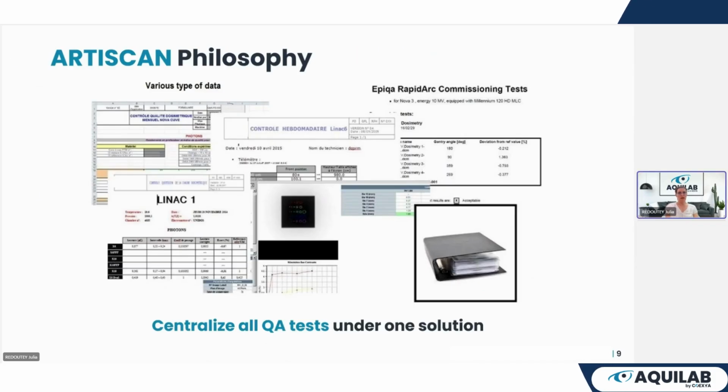So what's ARTISCAN philosophy? ARTISCAN is a full independent machine QA software platform. It is an all-in-one solution to ensure complete inventory of machine QA. It permits to define QA protocols and tolerances for each machine. It provides also independent global traceability, even on the most diverse platform and complex technical facilities.